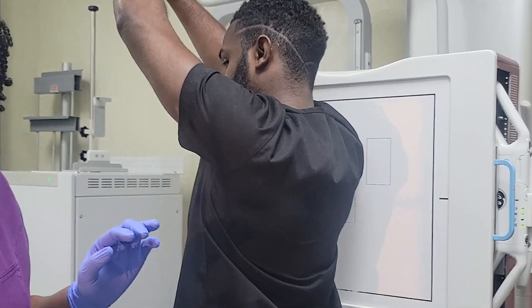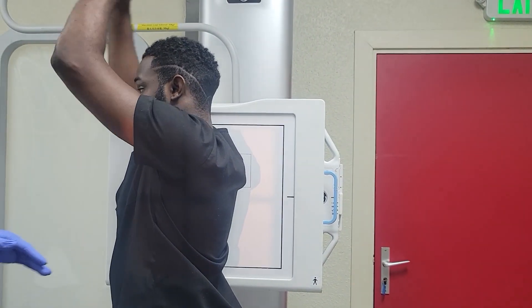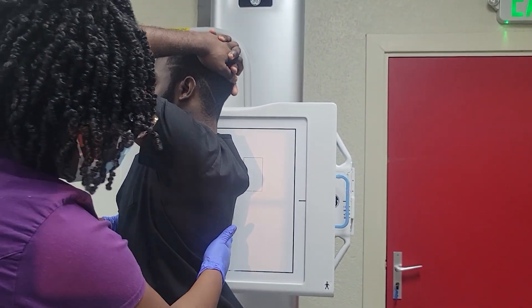Tell your patients not to slouch — if they're slouching they may be leaning more to one side, which is not what you want. You want them standing as erect, upright, and straight as possible. The next thing is to keep their chin up, not just to get it out of the chest area but to check overall alignment of the body. If the chin tilts to one side, the body tends to follow. So whether the patient is drowsy, weak, or tired, guide them to keep their head straight and chin up.